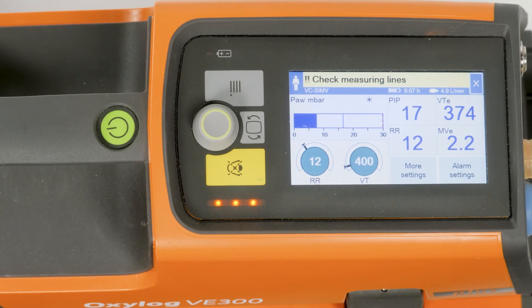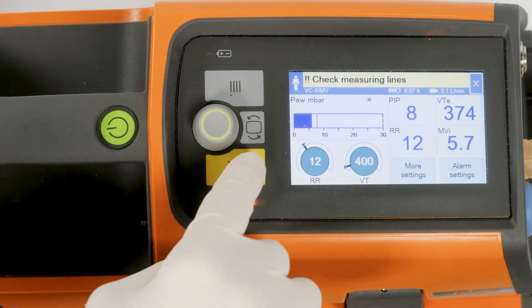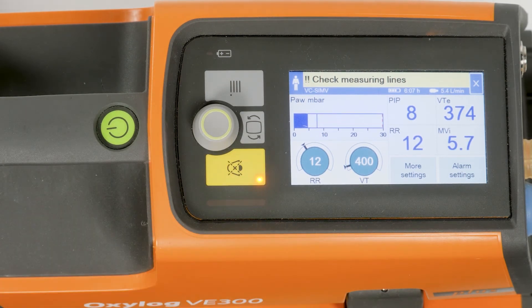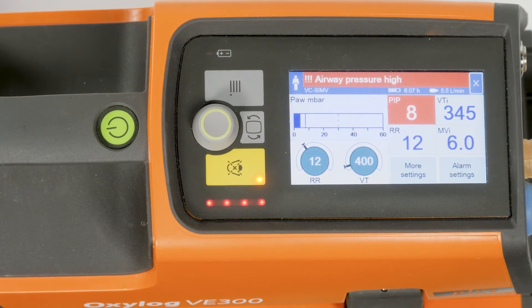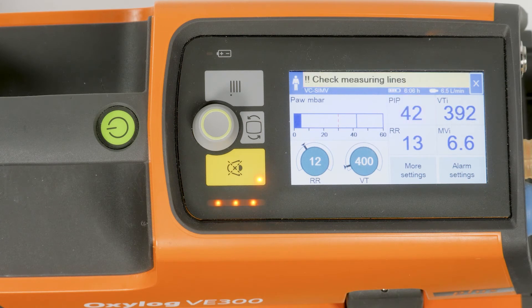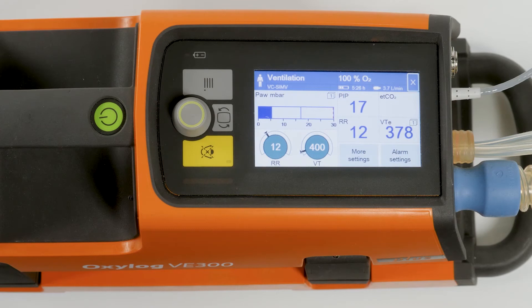New alarms with a higher priority than that of the silenced alarms override the alarm tone suppression, and thus are indicated by a one-time acoustic alarm signal. After the two minutes, all acoustic alarm signals are reactivated and the LED in the yellow key field goes out.